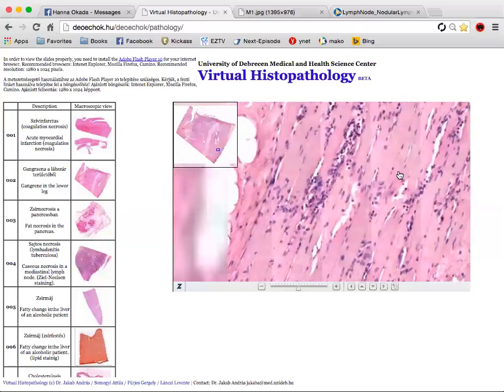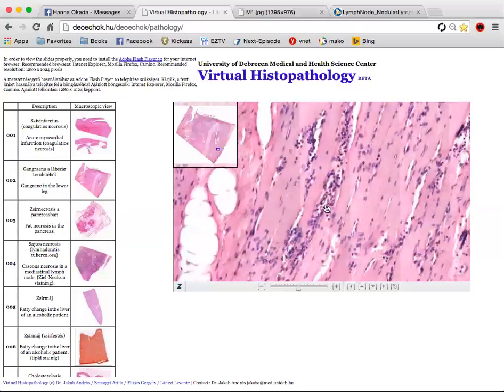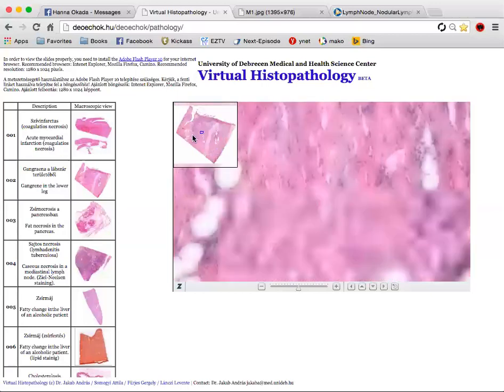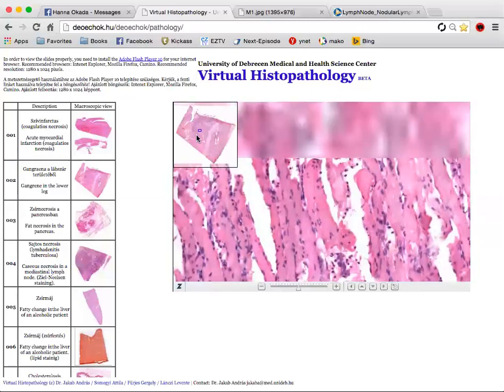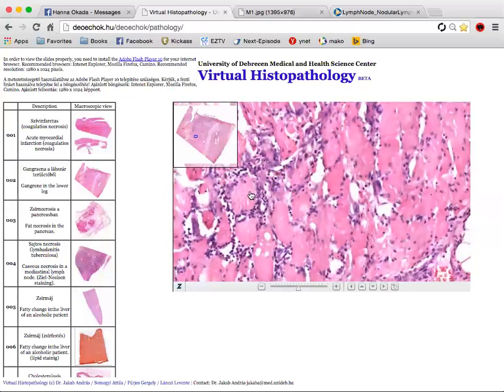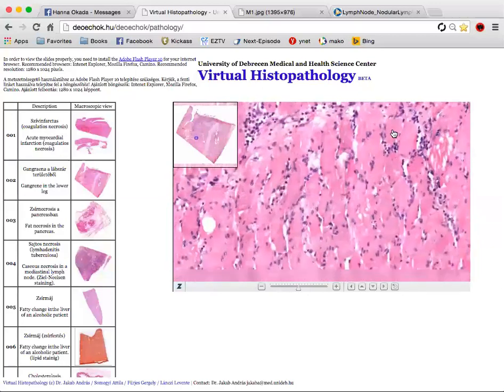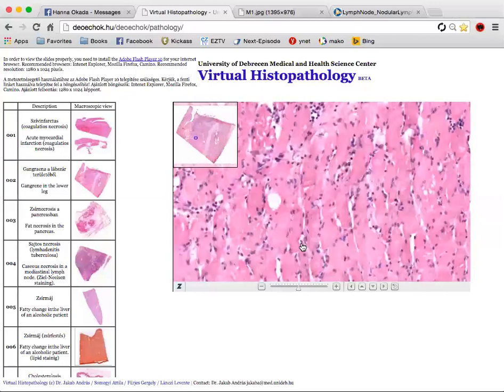So this is striated muscle, but you see there is inflammatory infiltrate already, and it's starting to lose the striations. The area that's very necrotic is here, and that might be what they actually show you in the exam. Going further here, you can see there's a lot of immune infiltrate, and the cells have completely lost their nuclei. It's not very nice looking like the normal muscle tissue.